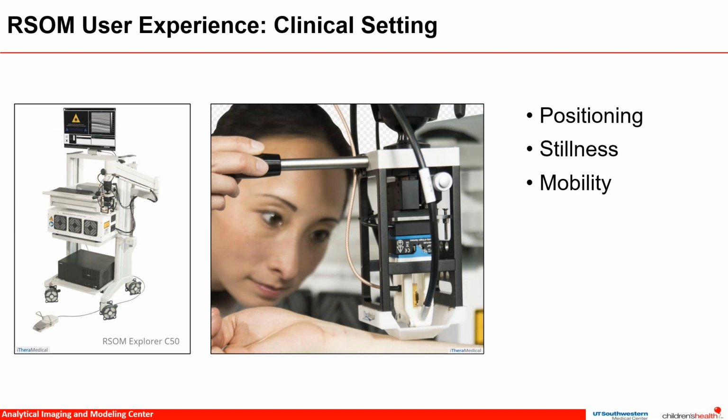We wanted to touch on the usability of the Rsom laser in a clinic and operating room setting. Because of the limits of angling with the scan head, we were required to adjust the position of the patient in the operating room to allow for a flat surface. This can be difficult when a patient is intubated, as there's a limit to rotation of their head that is safe and that can be maintained for the duration of the scan.